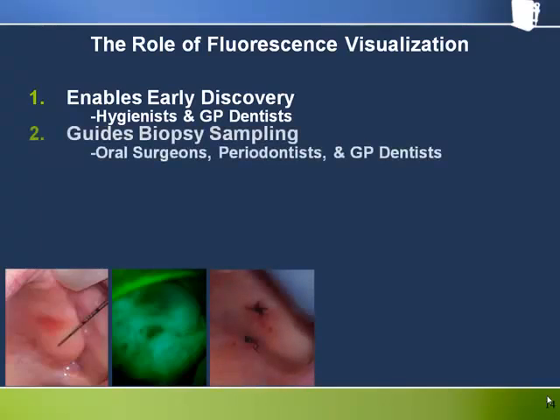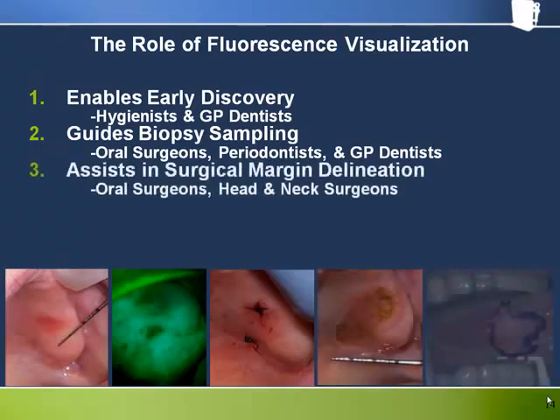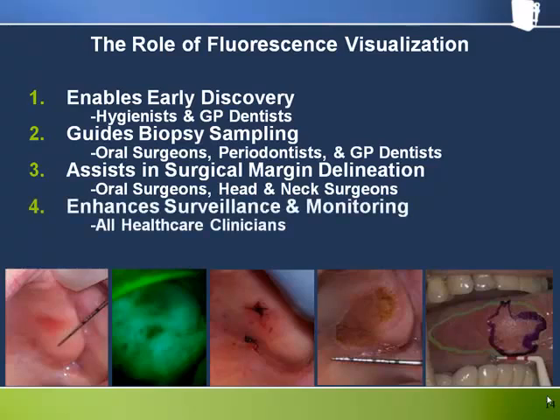For the specialists, such as the oral surgeon, periodontist, or the dentist, if they are so inclined, the tool can provide information that aids in the decision about the best location to biopsy the area. We've already touched on the utility for the surgeon as a tool to help identify the full area of abnormal tissue around a dysplastic or cancerous lesion, and thus aid in delineating the surgical margin for excision. Finally, after the therapeutic intervention has occurred, it is a tool for all members of the team to aid in the ongoing surveillance and monitoring of the treated patient.